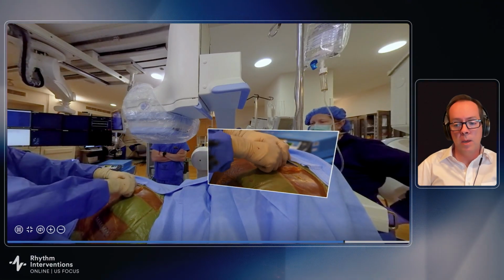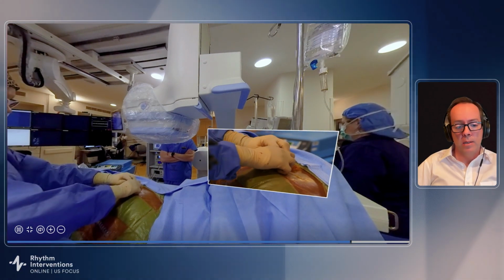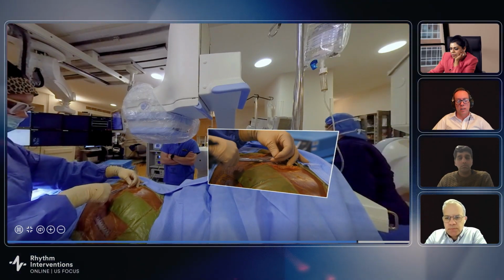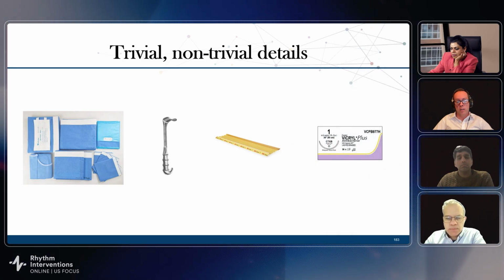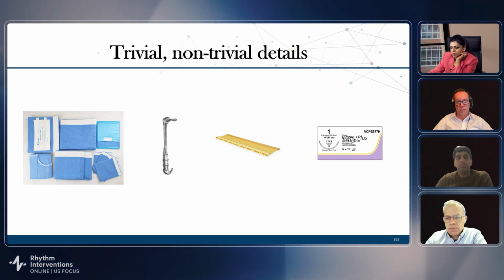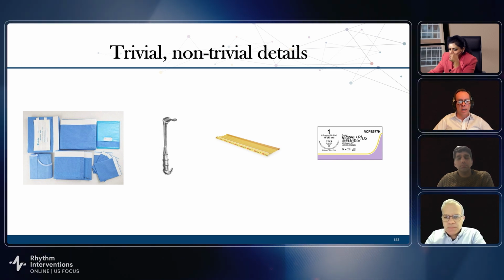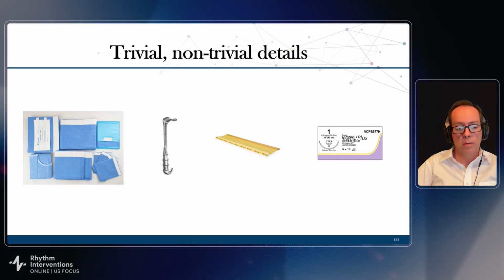I think Devi can sympathize with me. In Georgia, we have a lot of people with extreme truncal obesity in the South, and this sort of apple habitus is really challenging. And sometimes that lateral pocket is about 6 inches deep. So that's why these big tools with big radius needles are really important. So positioning, I spend way more time on positioning than any other case, because getting the arm out of the way and keeping a wide field is critical. And closure, I think, is perhaps the most important.